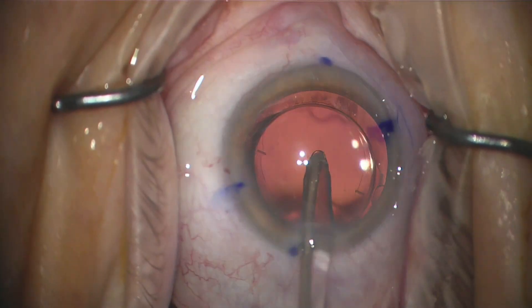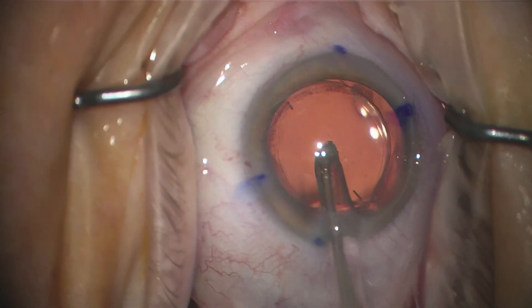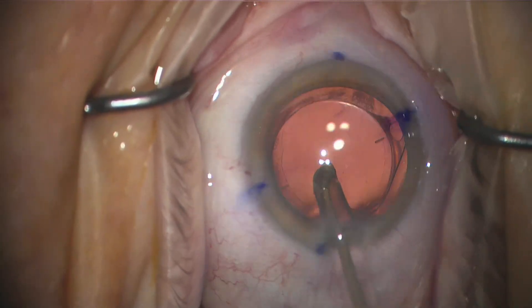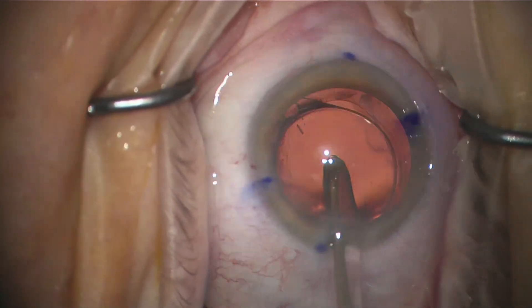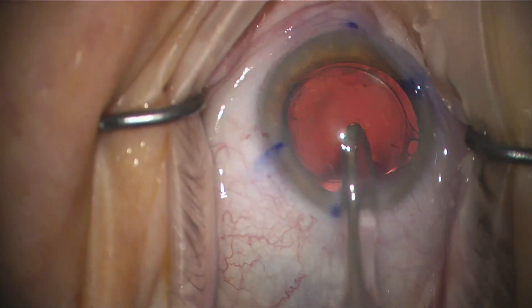And vice versa — when I rotate my tip counterclockwise to the left, the lens moves to the right. You can see that right here, it's moving that way. And now I'm moving it backwards, rotating the lens to the left counterclockwise while my tip rotates clockwise.